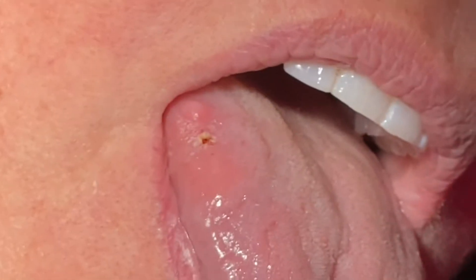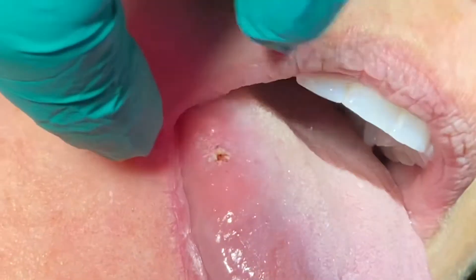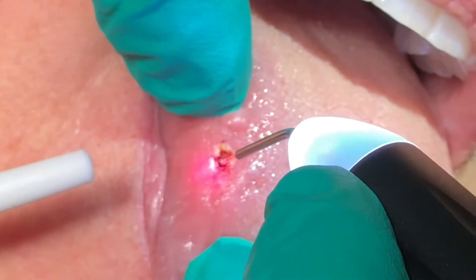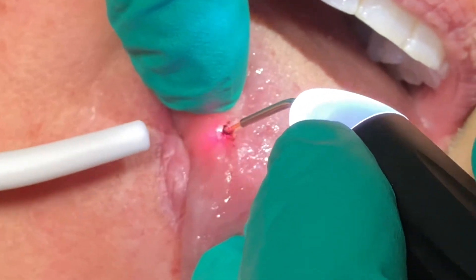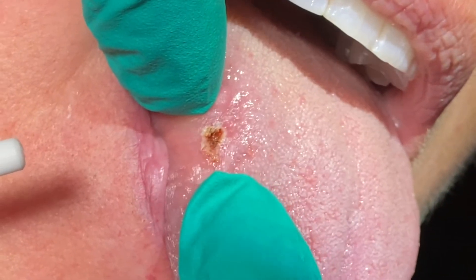I'm going to do one more thing real quick — just going to laze the base of that, because these things have a high recurrence rate. I can see there's a little bit of a base still there, so I'm just going to hit that for a few seconds, and we're done.